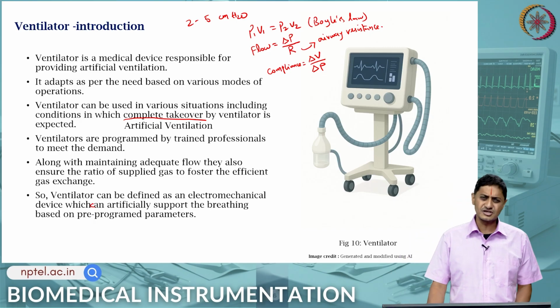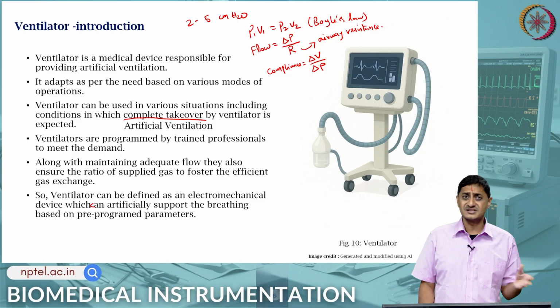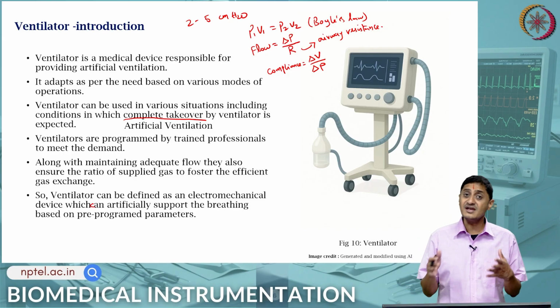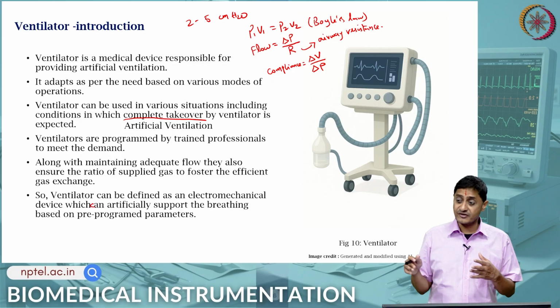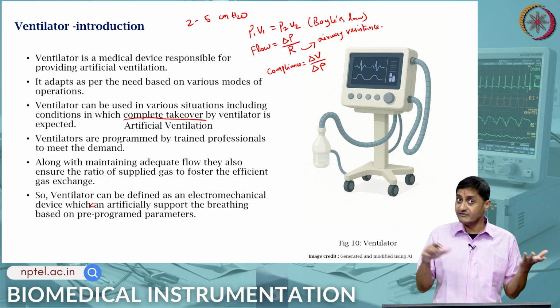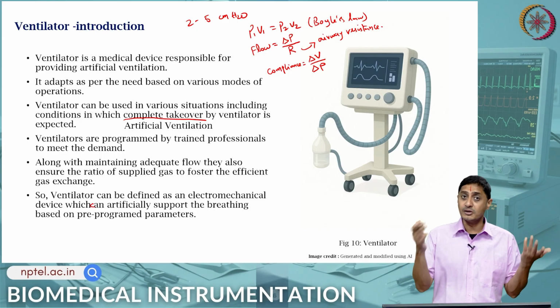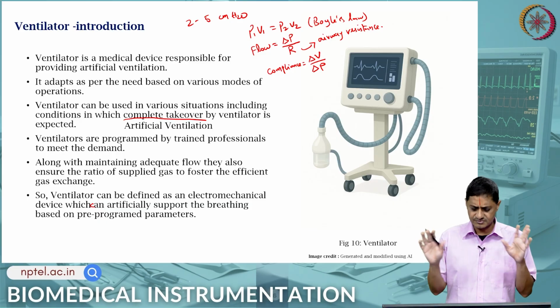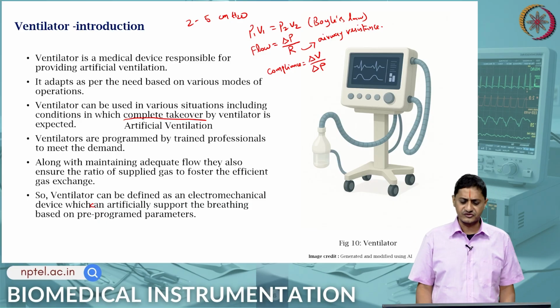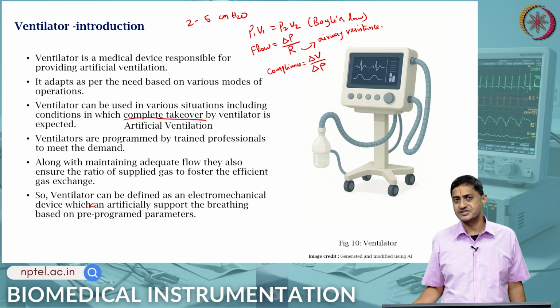That changes as a function of age, lung health and various, depending on whether the person is having COVID or not. By the way, it also varies as a function of where you are in your pathological journey. I mean, if you are recovering, then you might have had worse complaints, but then it might improve later on, and so on and so forth. It's a complicated topic beyond the scope of this discussion, but it's important to know these things, what is flow and what is compliance, for our future discussions.